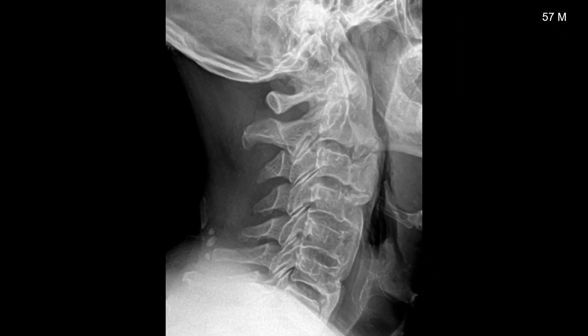This is a 57-year-old male with thick, exuberant calcification noted at the anterior aspect of C2, which is discontinuous, and then appears continuous and flowing all the way down to C7. There is relative preservation of the intervertebral disc heights as well as lack of posterior element involvement — classic appearance of DISH.